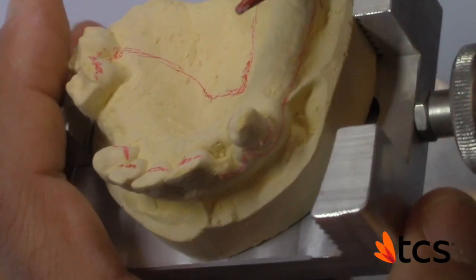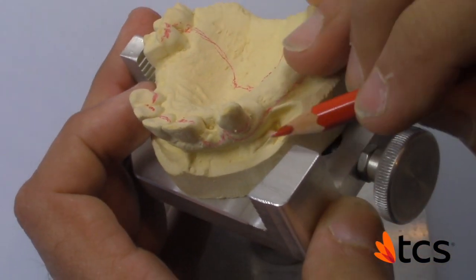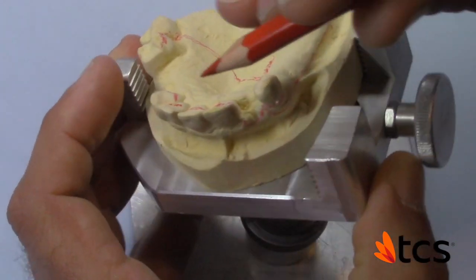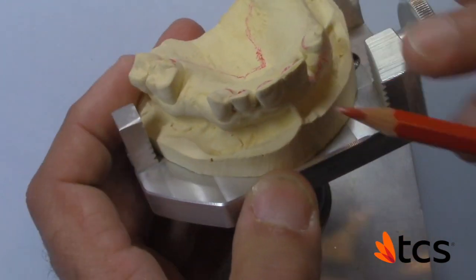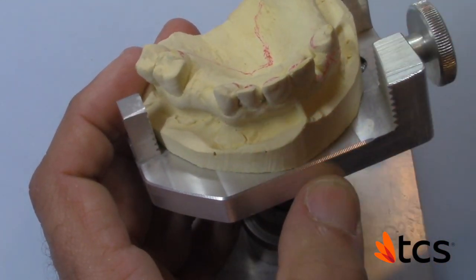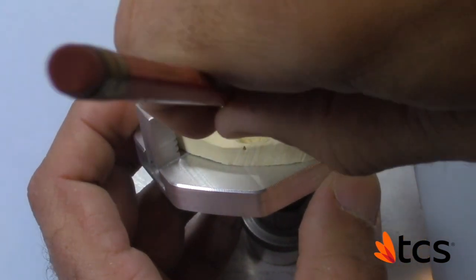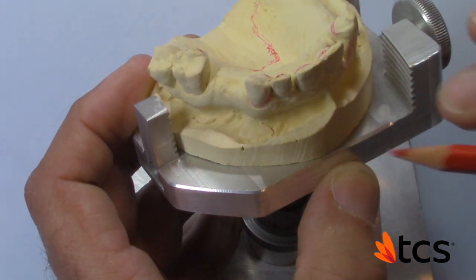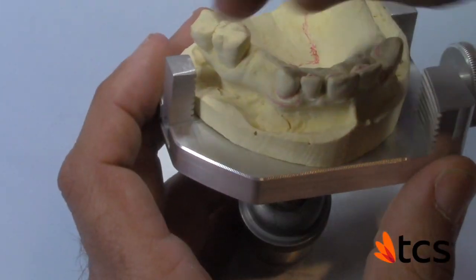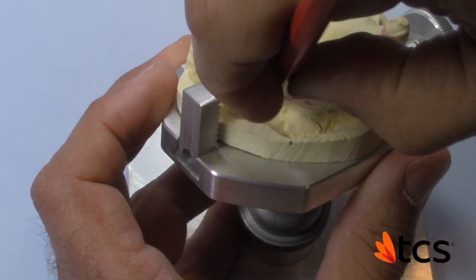Your wax-up is going to be a little more extended. These areas here, you're going to go a little higher just for finishing. Now if you notice, look at the margin here and look at the margin here — this is going to allow me to incorporate more tooth with my clasping so I could be more in harmony with the abutment. I'm putting a line right at the height of contour on my undercut, my tissue undercut. Very important.